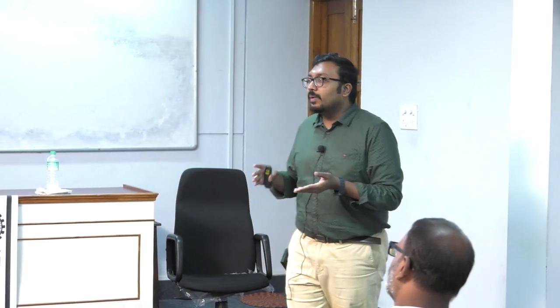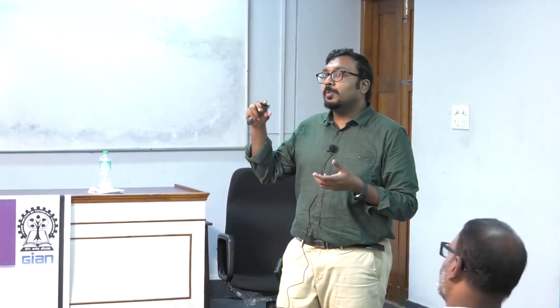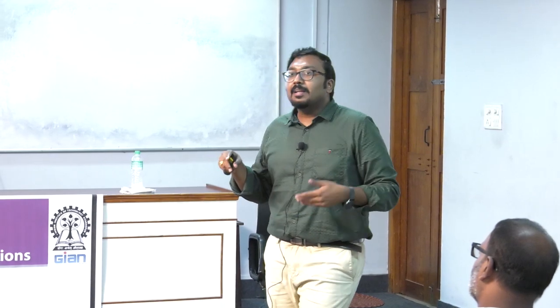That could be hemodialysis, which we are going to cover in this section, where the blood is taken outside the body, purified extracorporeally, and sent back to the body. Another mode is peritoneal dialysis, where the peritoneal lining below the abdomen, the patient's own peritoneal lining, is used to remove the waste metabolites.